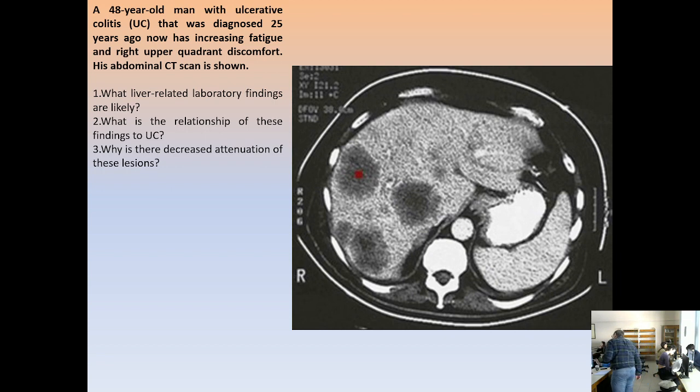That crosses the entire abdomen, let's say, and then these dark patches. There are three lesions, all right? How can you define them as lesions? Because they give a different signal than the rest of the liver. So, if it is cancer, and we have three foci of cancer in conjunction with the long-standing ulcerative colitis history of the colon, how can this be justified?